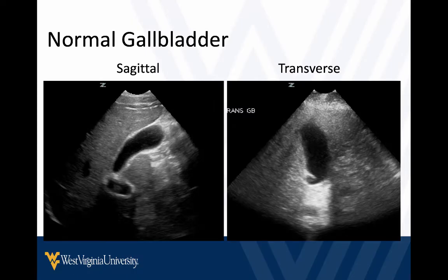So just quick reminders, again, not going to belabor this, but for the normal gallbladder, we want to look for the liver parenchyma, and we see what it looks like here, and if we get that nice reasonable exclamation point, then we know this is the portal vein here. The portal vein is the key to helping us find the common bile duct. If we look along the portal vein and there's no other dilated thing with it, then there's no biliary duct dilation. Just an example here of transverse, we see liver parenchyma all around it, and we see a little fold in this case, but we see nice, crisp, well-defined, thin walls, and these are normal gallbladders.